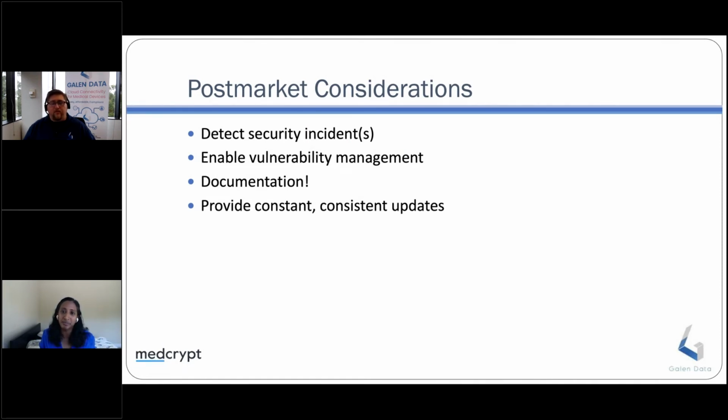Exactly. So as online communication for these devices becomes more and more prevalent, being able to keep track of that, being able to say, hey, 90% of my devices are on this version of the firmware and 10% are on this, and that 10% is vulnerable. We need to force those, develop a program for notifying the end users of that 10%, hey, you need to make sure this happens. That's all part of it as well.